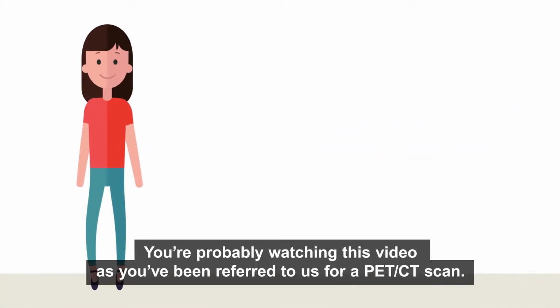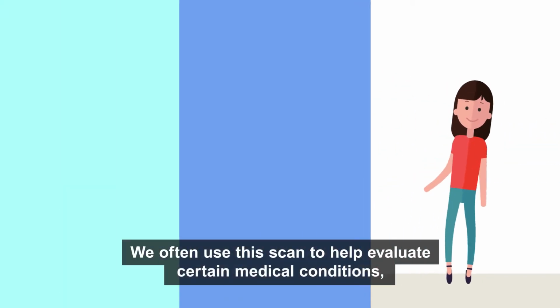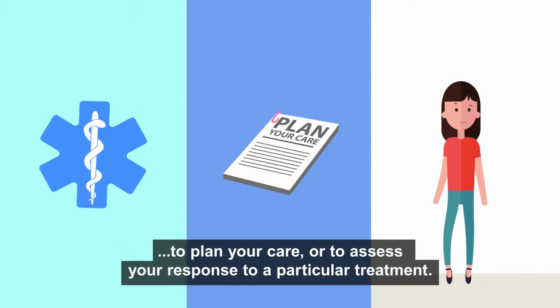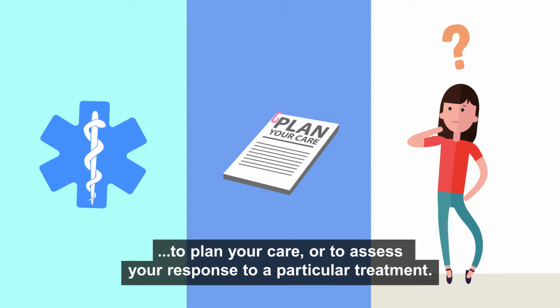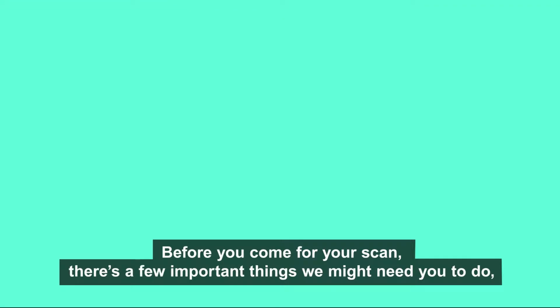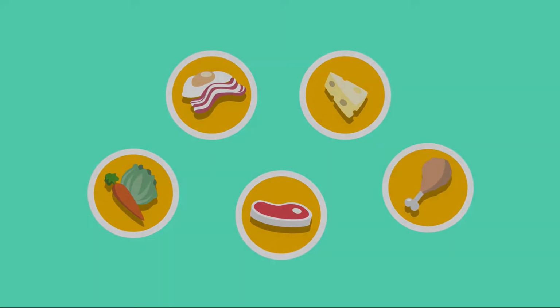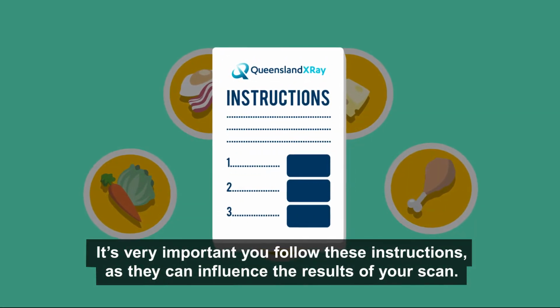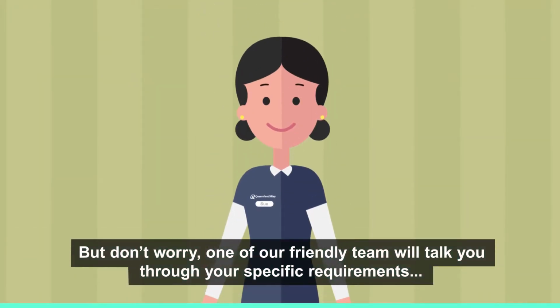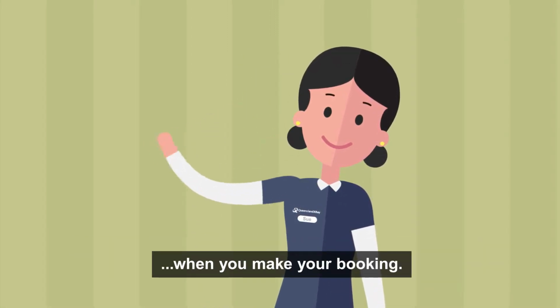You're probably watching this video as you've been referred to us for a PET CT scan. We often use this kind of scan to help evaluate certain medical conditions, to plan your care, or to assess your response to a particular treatment. Before you come for your scan, there's a few important things we might need you to do, such as only eating certain foods or fasting altogether. It's very important you follow these instructions, as they can influence the results of your scan. But don't worry, one of our friendly team will talk you through your specific requirements when you make your booking.